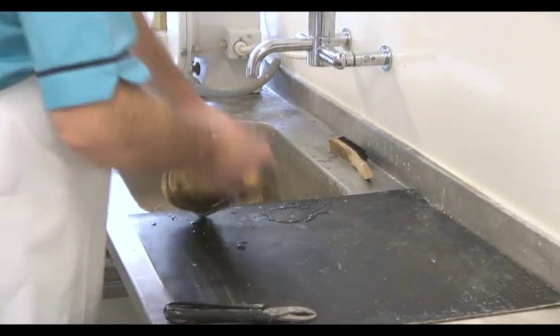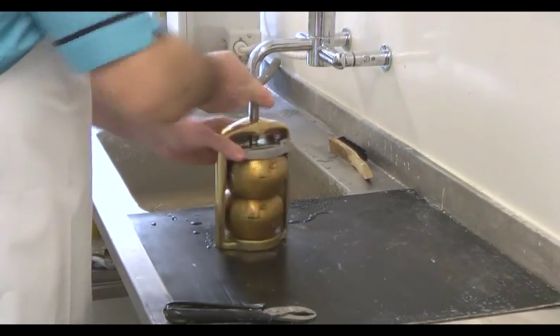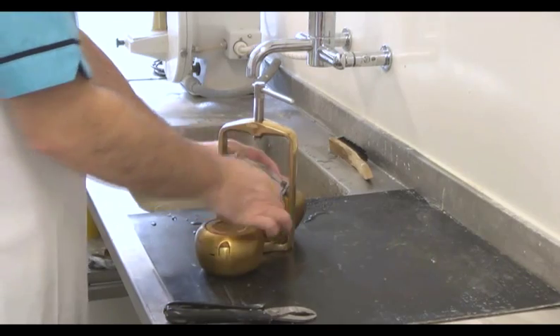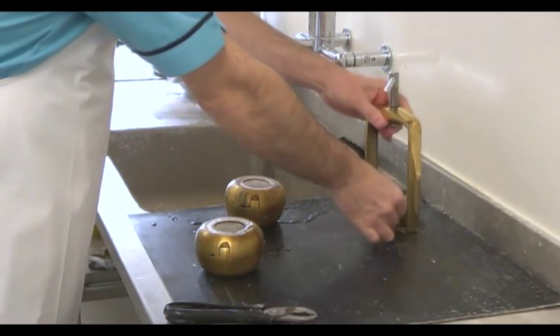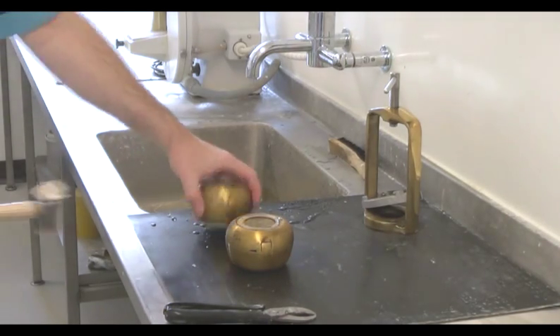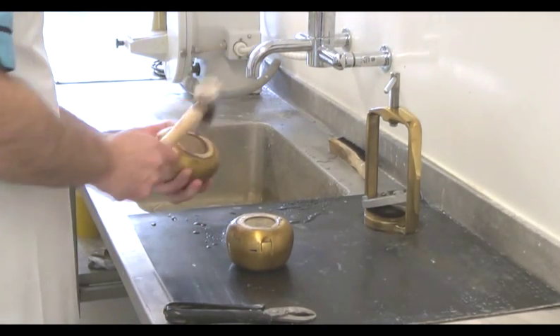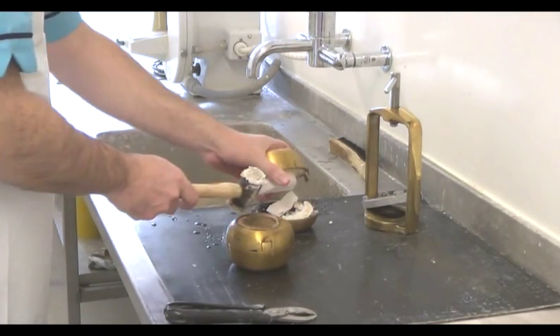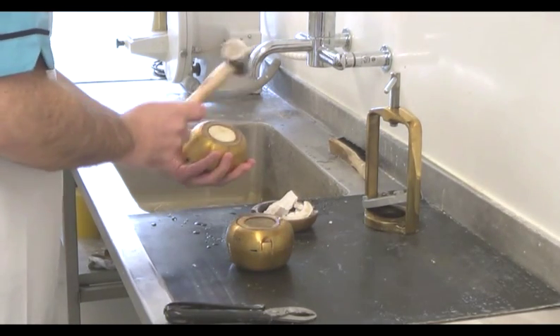After processing, the denture flasks are cooled down with cold running water. Once they're sufficiently cooled, the clamp can be opened and the dentures removed. We can remove the hard plaster from the mold using a rawhide hammer hitting the metal button on the inside of the flask. The same hammer can be used to separate the stone from the flask once opened.